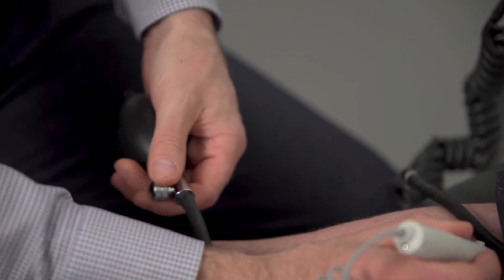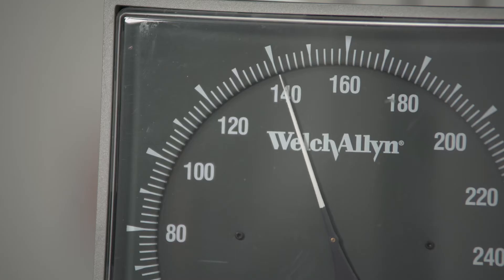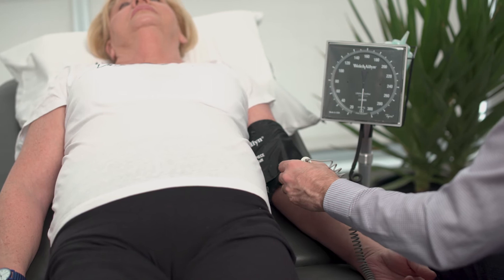We are going to gradually release the pressure until we hear the signal again. This is Mrs. Beauchamp's systolic blood pressure, which is 130 millimeters of mercury. So that becomes our denominator for the ankle brachial index. We also have to measure the pressure of the left arm.